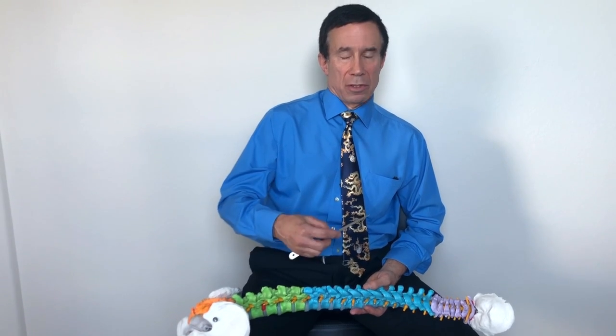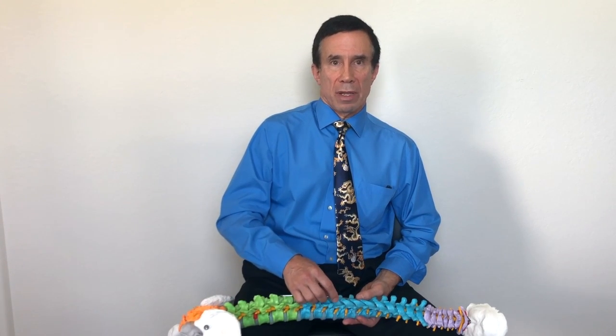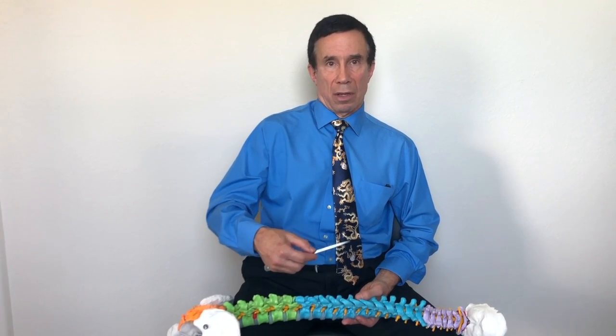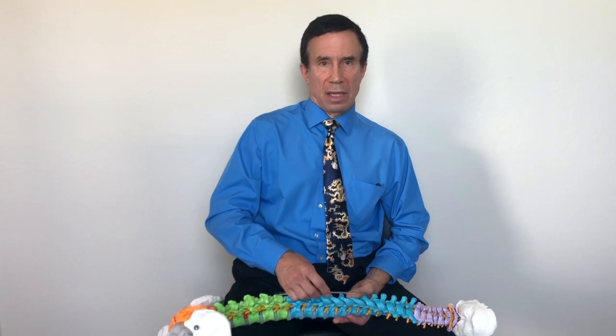A stimulation trial typically lasts 5 to 7 days, and the patient is encouraged to live his or her life as normally as possible in order to learn what impact pain relief might have on his or her life. Things that a patient is instructed to think about include pain relief, activity level, and quality and quantity of sleep. At the end of this 5 to 7 day period, the patient comes back to the office.